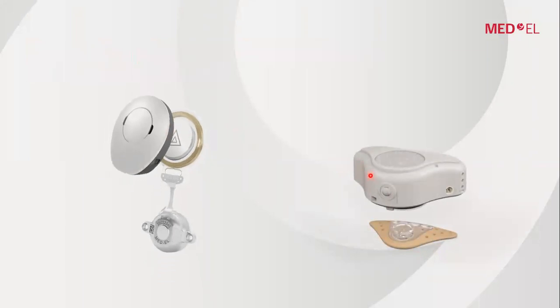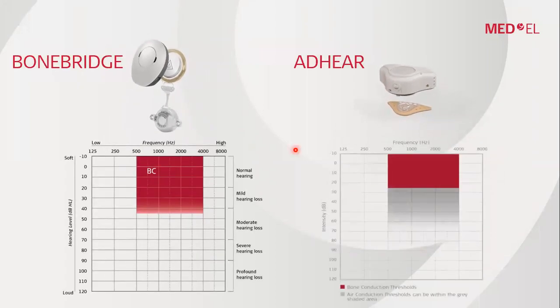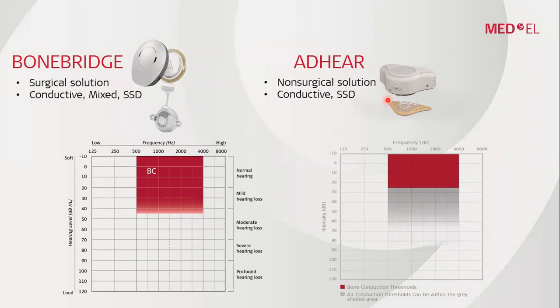So now let's have a quick comparison between the two solutions before talking in much more detail about them. The BONEBRIDGE is a surgical solution, while ADHEAR is a non-surgical solution. The ADHEAR should be the ideal solution for conductive hearing loss patients who cannot or choose not to undergo a bone conduction surgery. BONEBRIDGE is for conductive and mixed hearing loss in addition to single-sided deaf, while the ADHEAR is for conductive and single-sided deaf patients only.